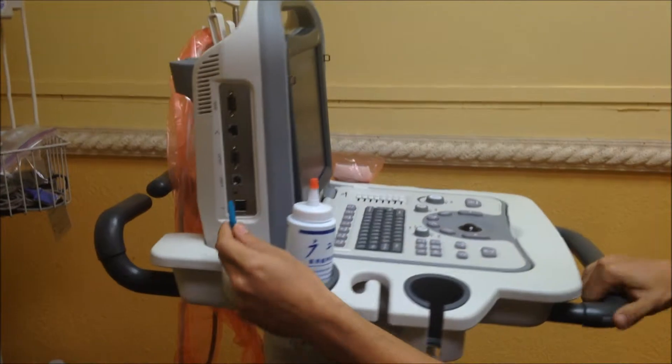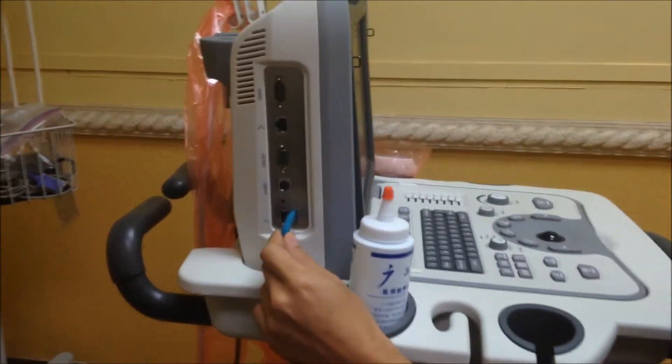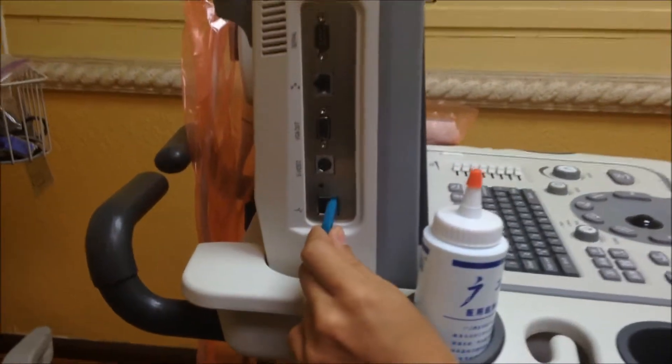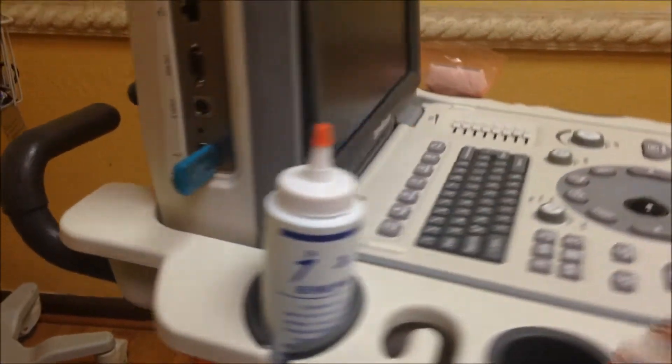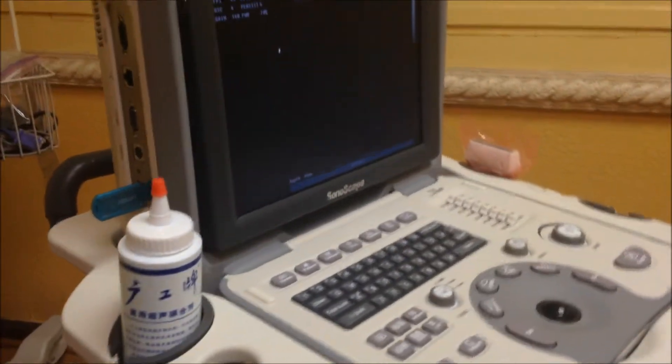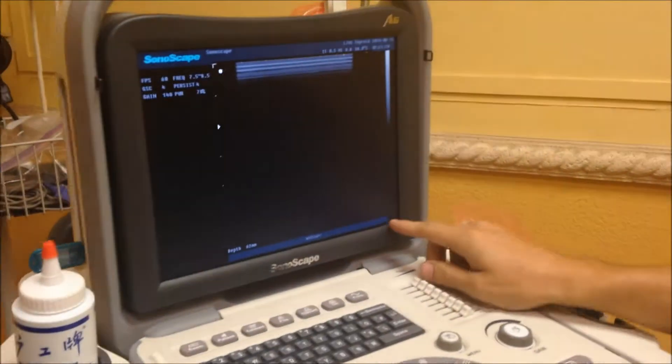So first thing, we're going to plug in the USB into any port, really. And it's going to actually recognize the USB. See right there? It just recognized it right there.